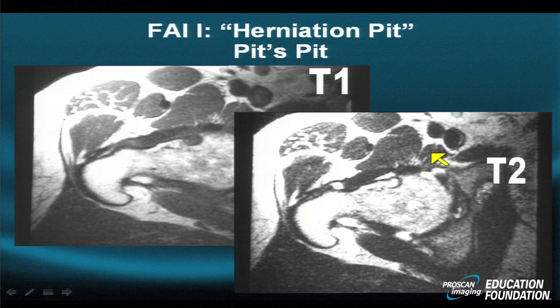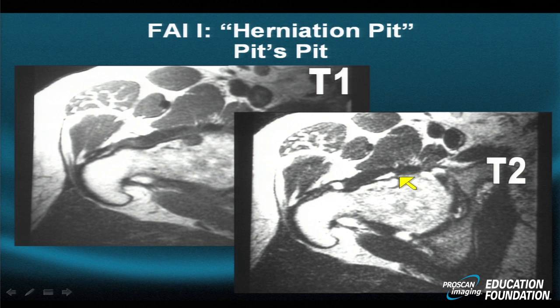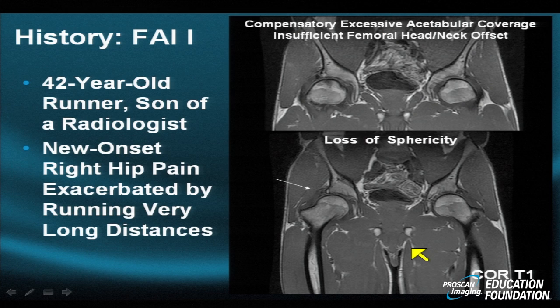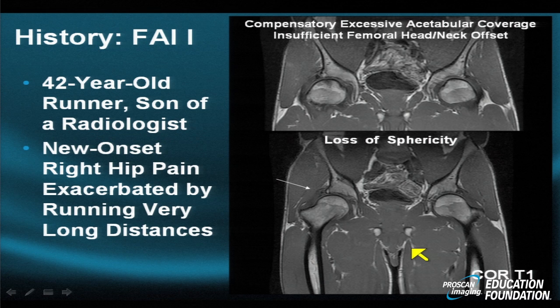There's the pseudocyst — non-epithelial lined intraosseous pseudocyst — with swelling above. On the T2 axial image, one can subtly see the bump, the pseudocyst, a little capsular fluid, and a small amount of fluid throughout the joint. This small pit has been referred to as a 'pit' in the past and given many names, but it is no different histologically than any of the other non-epithelial lined intraosseous ganglia seen throughout the rest of the body, induced by repetitive impaction and friction.